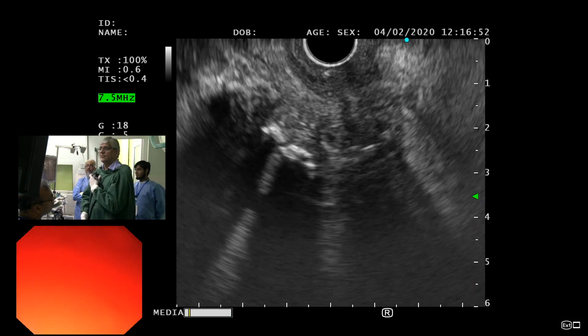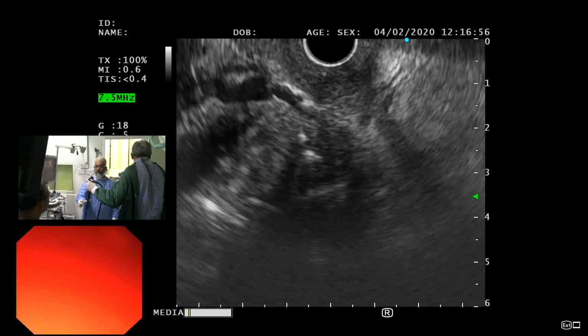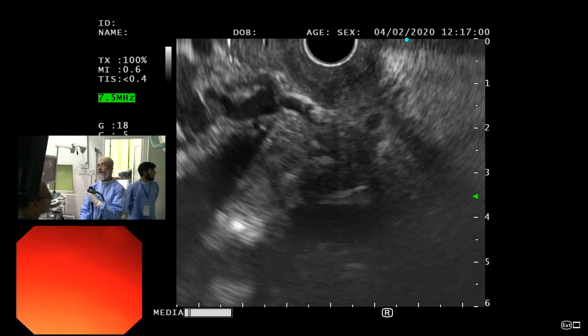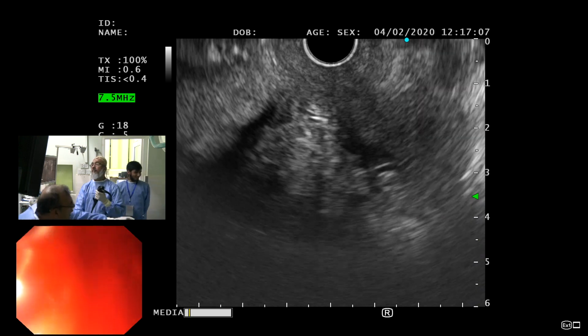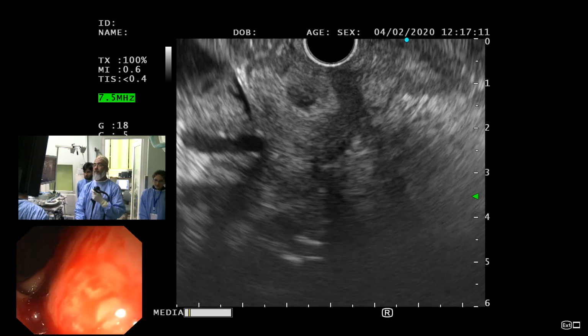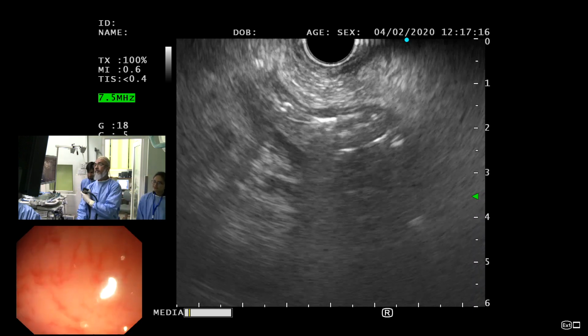I think we should have enough sample there. I've taken more passes than I normally do. आप इसको देखें. एक मिनट देखें. टिश्यू है? हाँ? आ गया टिश्यू? कैसे बता? स्लाइड नहीं, मुझे टिश्यू चाहिए. है? निकाल दूं बस?